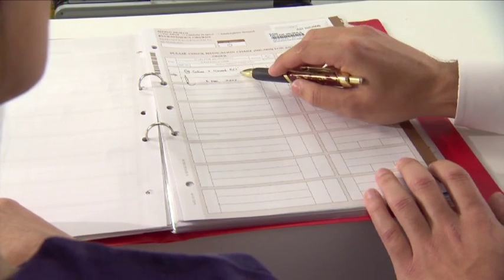Sure. I've just noticed Mrs. White has a low potassium, which needs to be replaced intravenously. I've written her up for 10 millimoles of potassium chloride with some normal saline. Right, she's had an axillary clearance on the left-hand side, so, given the concentration of potassium, I'll put a small device in a good-sized vein on the right.